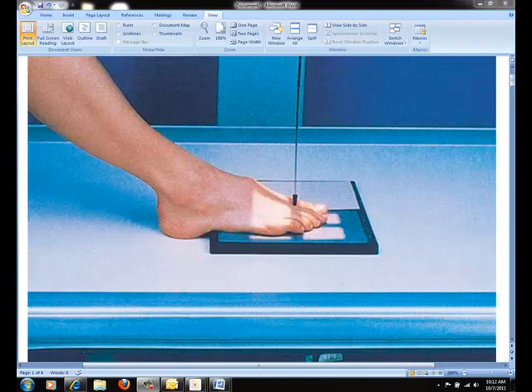When showing the joint spaces is not critical. To open the joint spaces, you may either direct the central ray 15 degrees posteriorly through the third metatarsal phalangeal joint, or place a 15 degree foam wedge underneath the toes. Then direct the central ray perpendicularly.